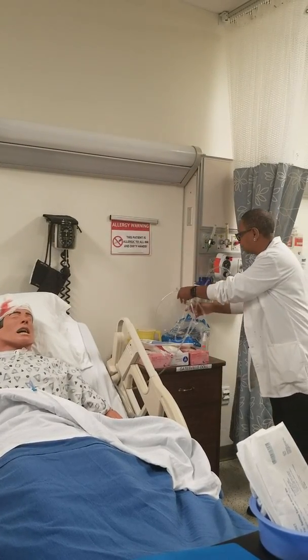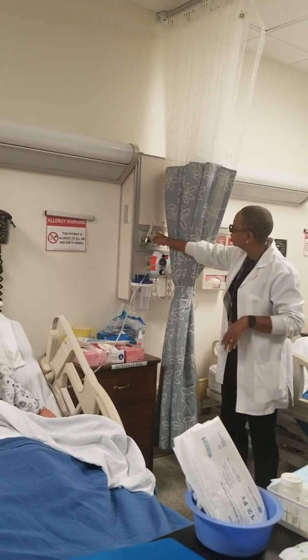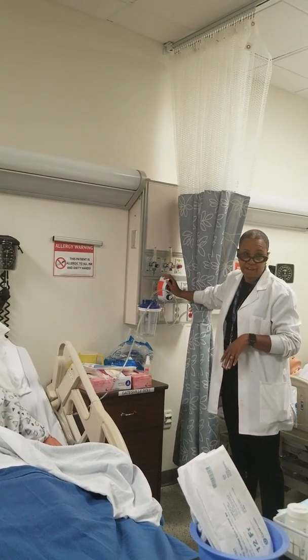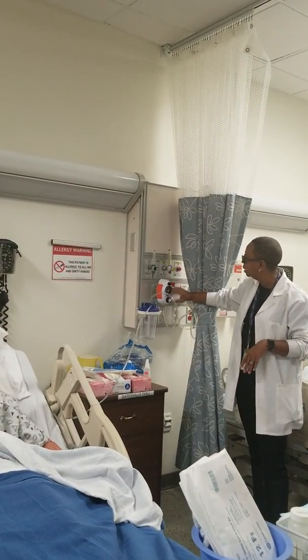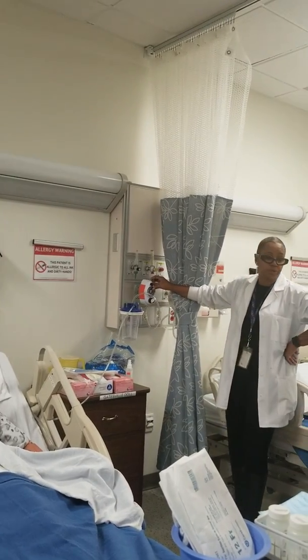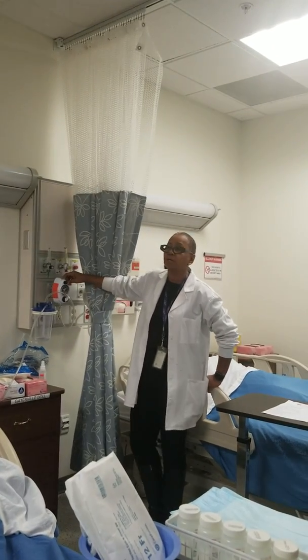because I might have to oxygenate him. So you have two things on the wall. This is your oxygen source, right, okay? And this is your vacuum. Your vacuum is what you use for suction, okay? So if you look at it, you have an off switch here. Oh, whoa, that's big, should be like, off switches here, and what else?